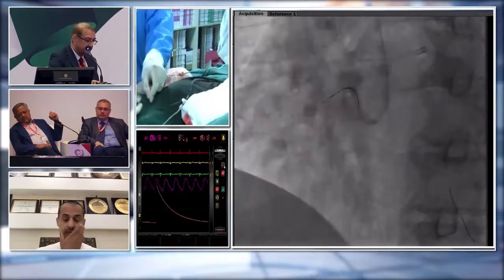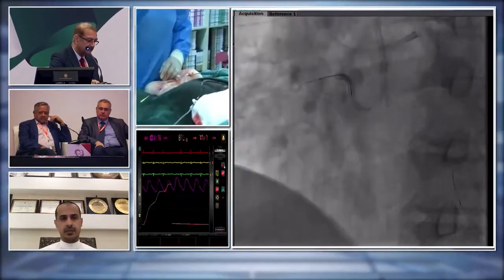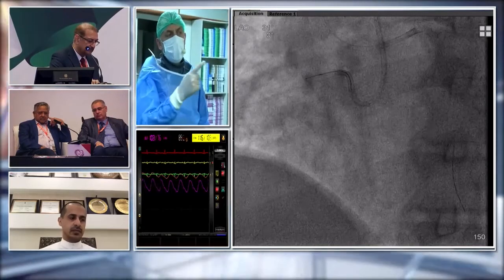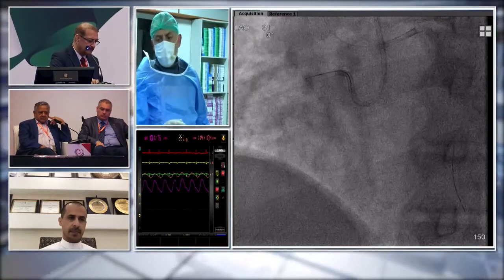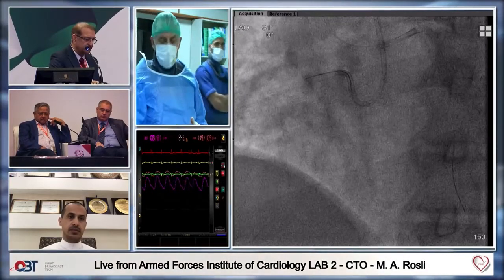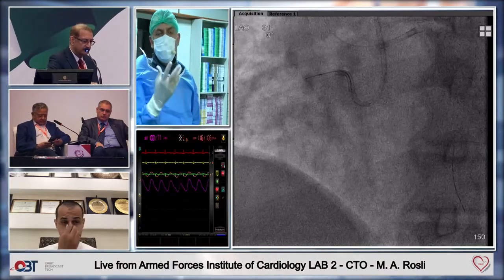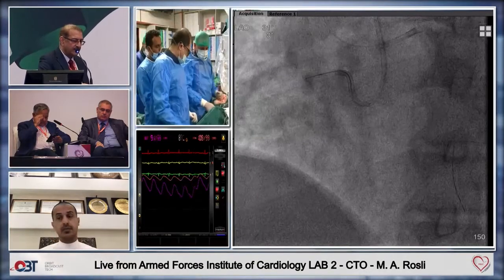So first, as a first wire, my microcatheter is Fine Cross for today, and I choose Pilot 50. I choose it for two reasons. One, I need a workhorse wire anyway to go to the CTO. So I take Pilot 50. I will try 1 or 2 minutes to see if I can cross this lesion with Pilot 50. If not, I go directly to a second wire, or we can use any other stiff wire here, because it's a short, straight lesion. Judo also could be a good choice here as well.